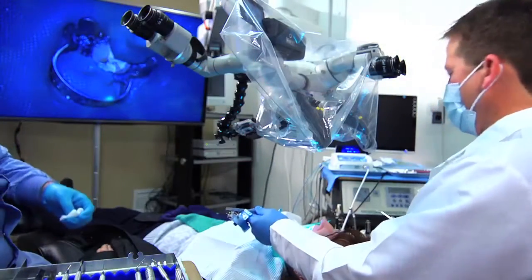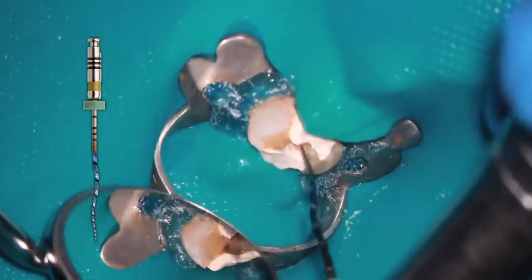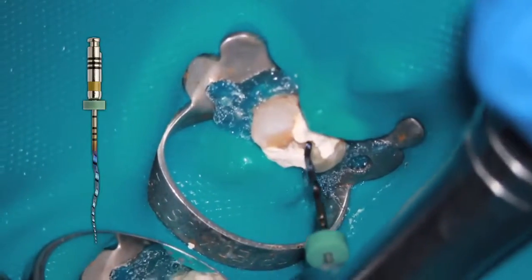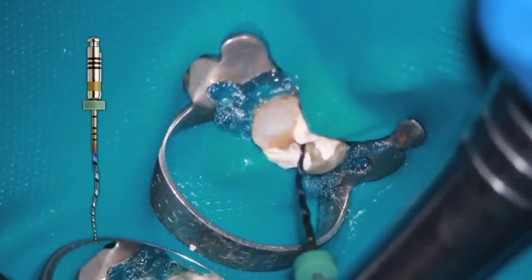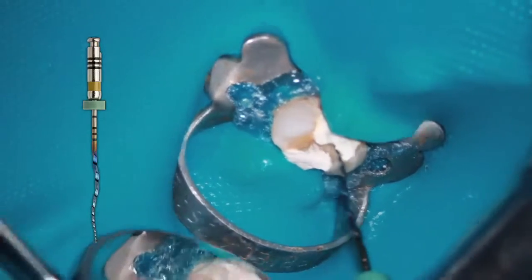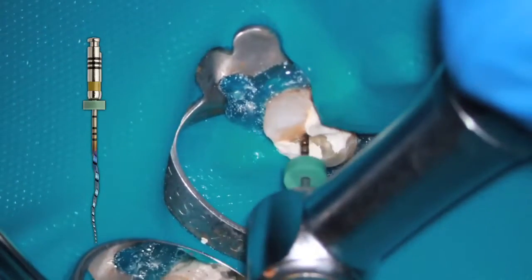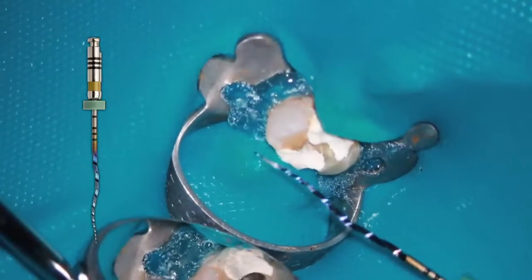When using TRUShape, you want to remember that as flutes become clogged, they become less efficient. It's like your razor if you don't run it underwater. So whenever using any rotary instrument, especially these, with their unique metallurgy, what you want to do is make sure you don't start it in the canal, but also you want to go 3 passes before you come out and clean off the flutes. So we don't want any resistance. So 1, 2, 3, and out. And there's debris as we advance apically.